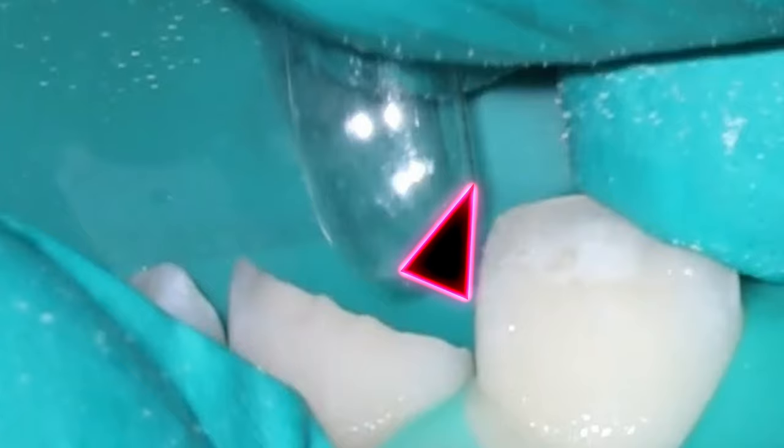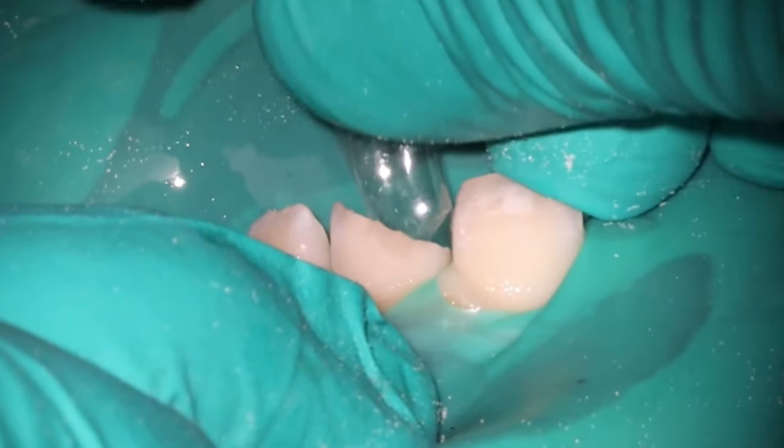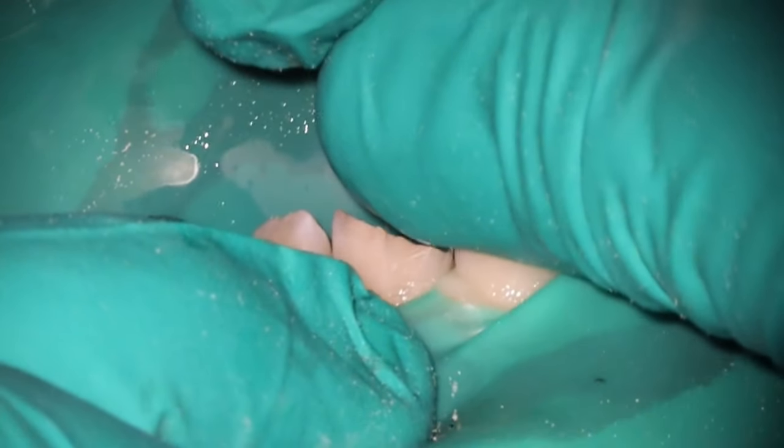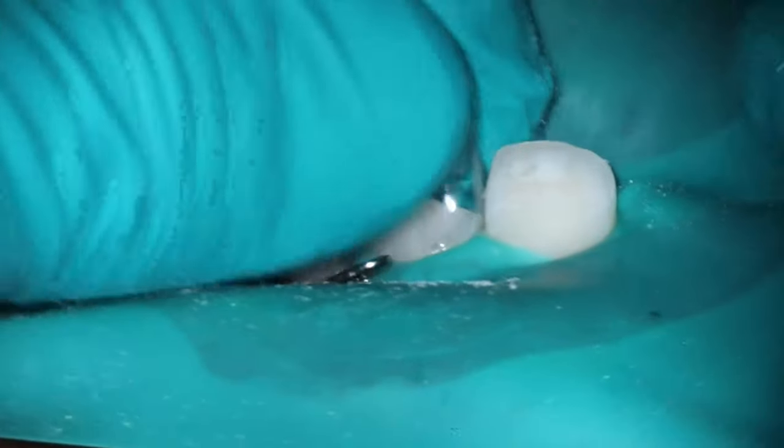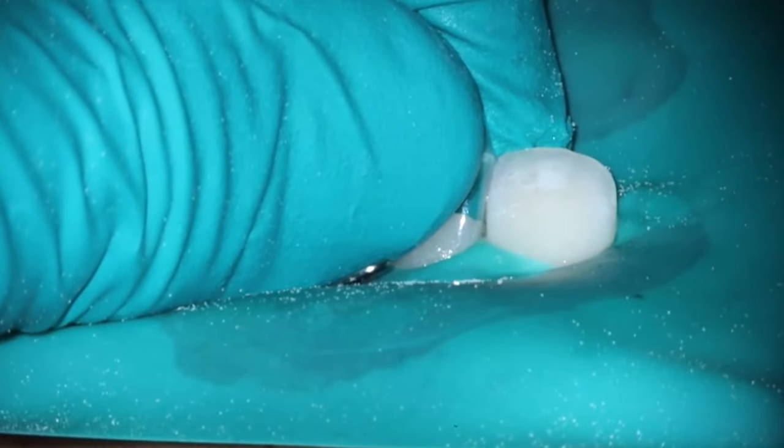But this is a trick if you're working on younger patients and they have that really healthy interproximal papilla, you actually want to remove this little triangular shape to give enough space so that it fits inside there. And so this is what it looks like inside the mouth. Fits down nicely. You can see we get a really good, solid, snug, tight fit there. Before, I tried to fit it in there, and the gum tissue was so tight, it would actually push it back out. So we don't want that.